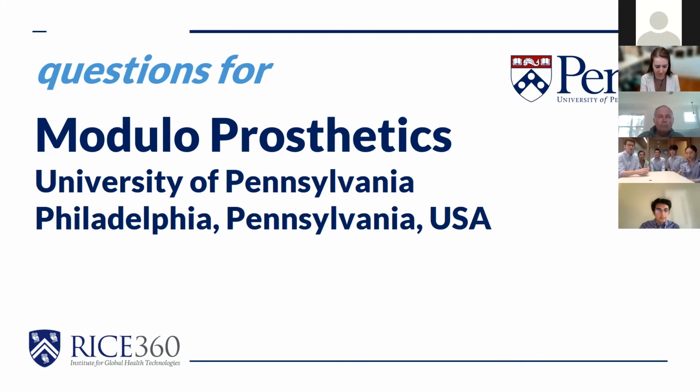Definitely. We know that we use the 3D printed nature of it, and that's a pretty accessible thing here in the States, though it is much more expensive in maybe low resource countries. At least our vision with this was, even though it would be a little bit more expensive, we think it's really nice that they would at least have those facilities to be able to do it instead of relying on machining the parts somewhere else or creating them somewhere else and then having to ship those. Because it's based on 3D printing, the cost could definitely go up in places where the material and manufacturing are more expensive, but we hope that just giving them the accessibility helps as well.